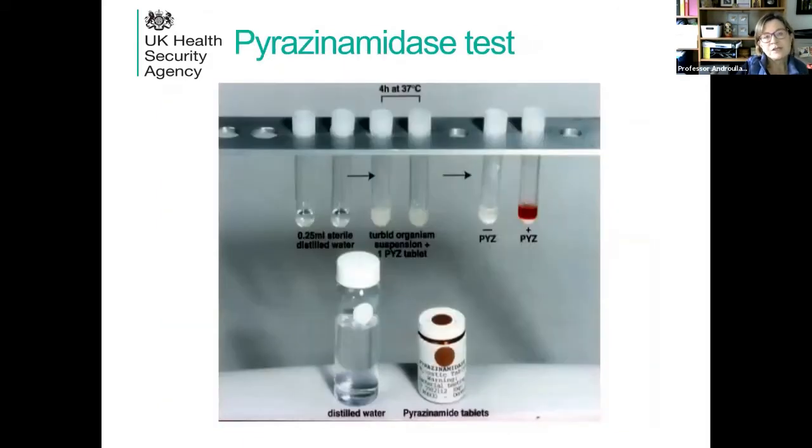This is the pyrazinamidase test, where all C. diphtheriae, C. ulcerans, and C. pseudotuberculosis are always PYZ negative. Other corynebacteria are PYZ positive. This is a commercially available test.